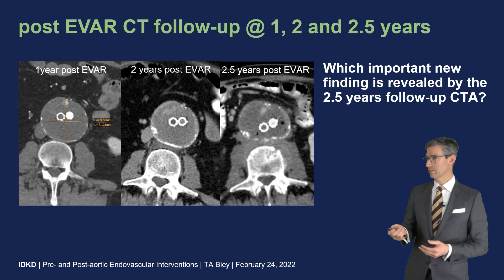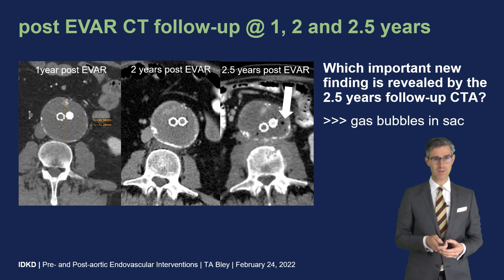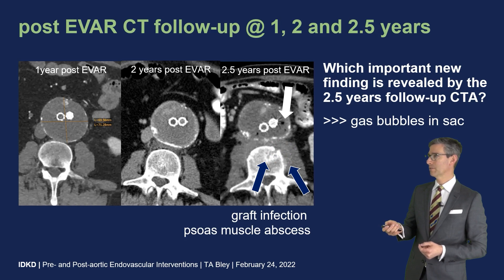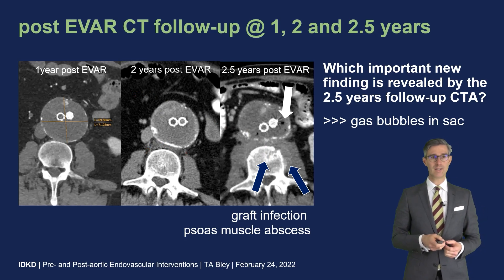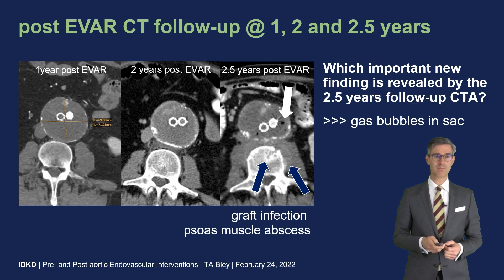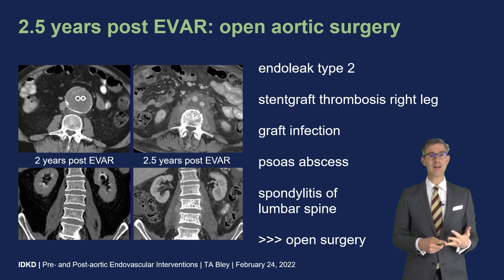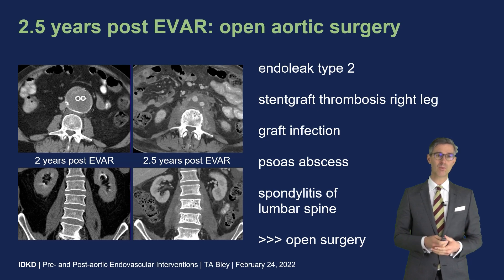Follow-up at two and two-and-a-half years revealed one more finding: new gas bubbles within the aneurysm sac, which is truly concerning. Looking closely, there is also a psoas muscle abscess continuing all the way to the lumbar spine. Looking back at the two-year image, there is stranding on the posterior aspect of the aortic aneurysm — a potential early sign of infection. This patient had a type II endoleak, stent graft thrombosis of the right leg, graft infection with a psoas abscess, and spondylitis of the lumbar spine, and required open surgery with stent graft removal.